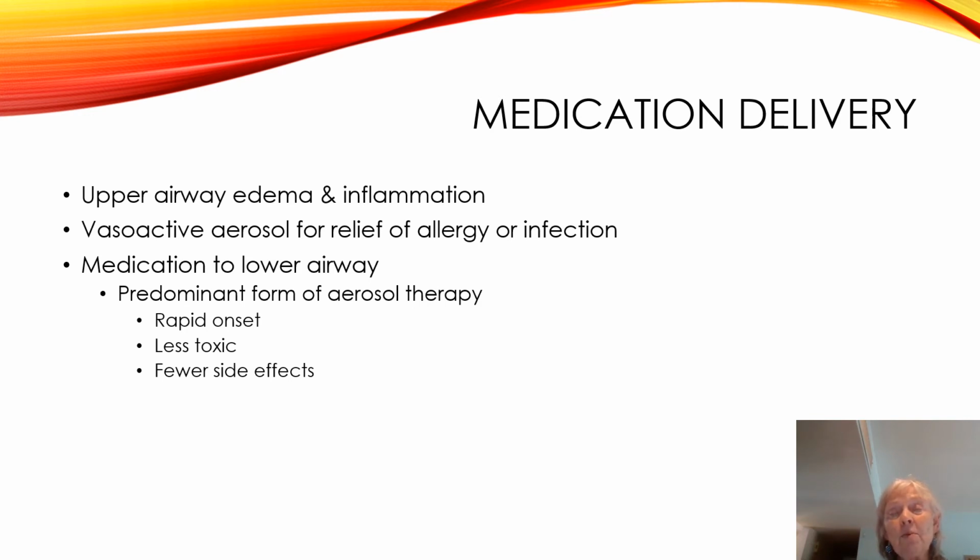And we can give tobramycin by small volume nebulizer. We also then medicate the lower airway. And the reason we do that is because we can get the medication down there. And we're going to talk about the particles, because particles and where they deposit or how deep they penetrate are going to determine how much medication we're going to get into the lower airways. Question is then, why do we use aerosol therapy?